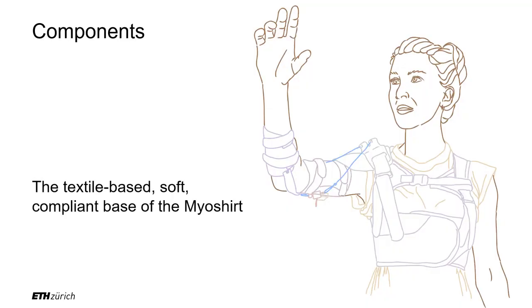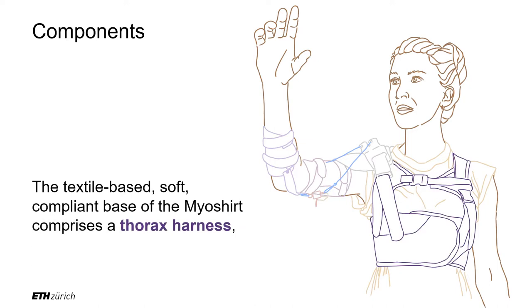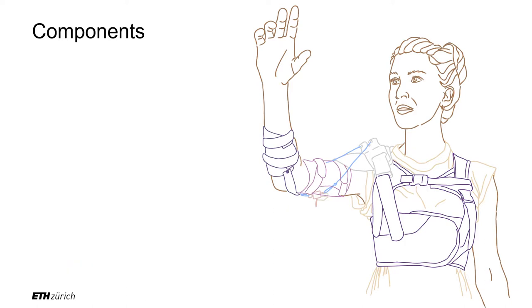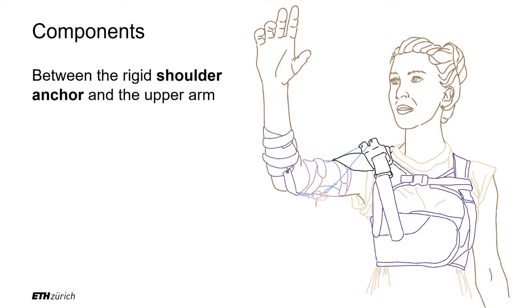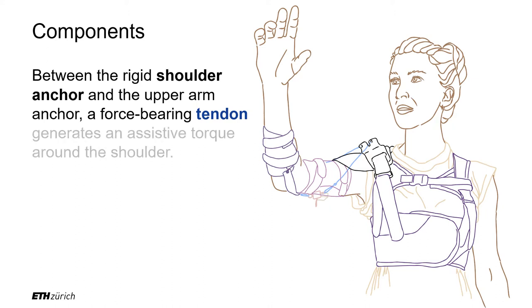The textile-based soft compliant base of the Myoshirt comprises a thorax harness, an upper arm anchor, and a forearm cuff. Between the rigid shoulder anchor and the upper arm anchor, a force-bearing tendon generates an assistive torque around the shoulder.